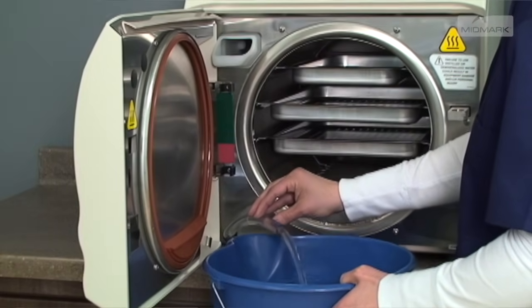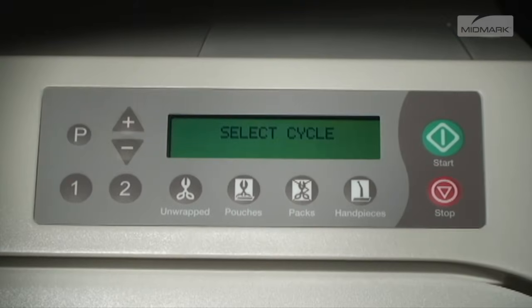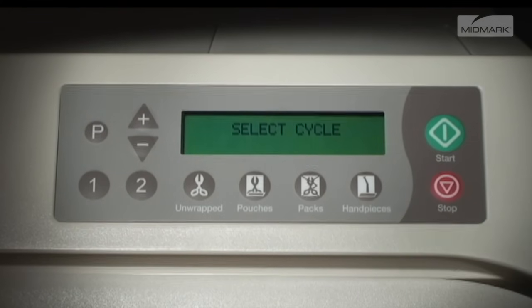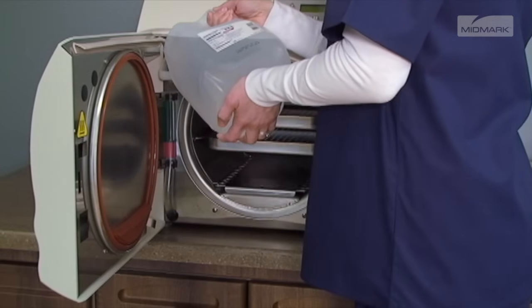Drain the reservoir again and refill a second time with clean distilled water for the rinse cycle. Rinse by running one unwrapped cycle. Push the stop button when the drying cycle begins. After the cycle has completed, drain and fill the reservoir with clean distilled water, then allow the sterilizer to cool.